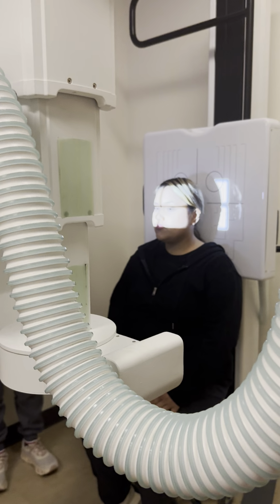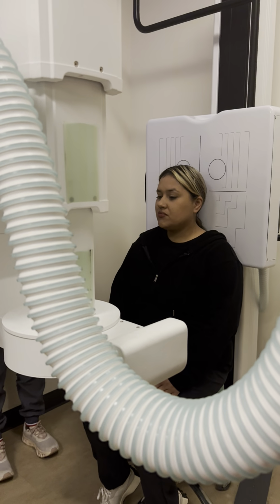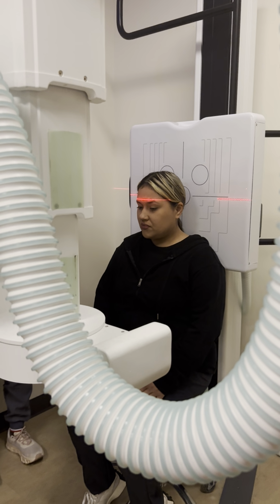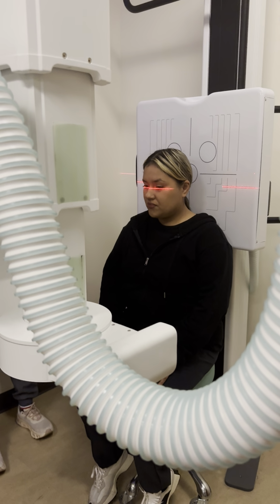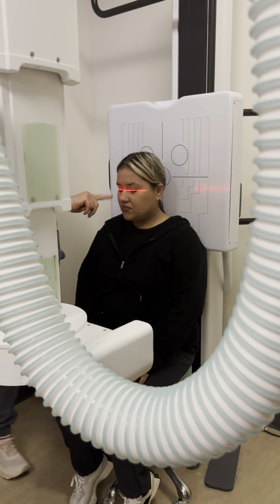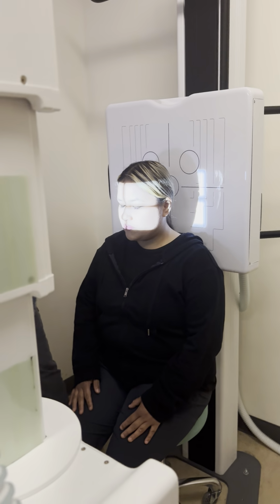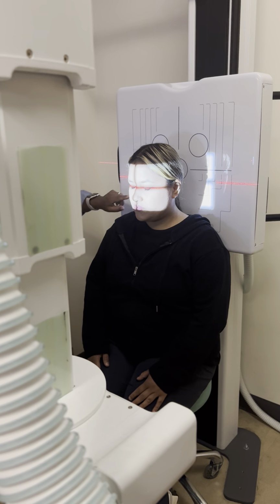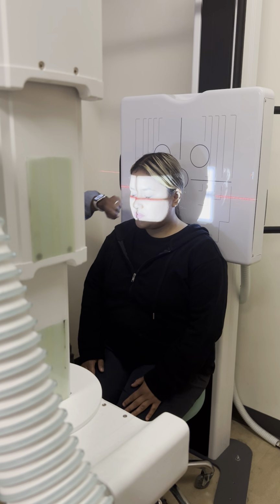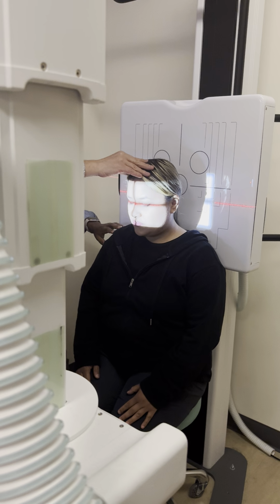So we're at the Nasion for her. We're going to have her tuck her chin down such that this line, as we drop it down, is the outer canthus. Close your eyes for me if you would. The outer canthus is there to that ear hole. So when we drop it to the ear hole, watch what happens. There's the ear hole. Now we need to bring her eyes down to that, right there. So we're matching it. That is the OML line.